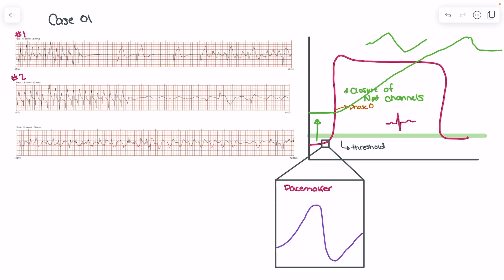And what we can see here is you see those big wide complexes here in rhythm number one, and you see that very clear sine wave rhythm here, which is highly indicative of the basically prolongation of phase zero, the closure of the sodium channels that we see in hyperkalemia.